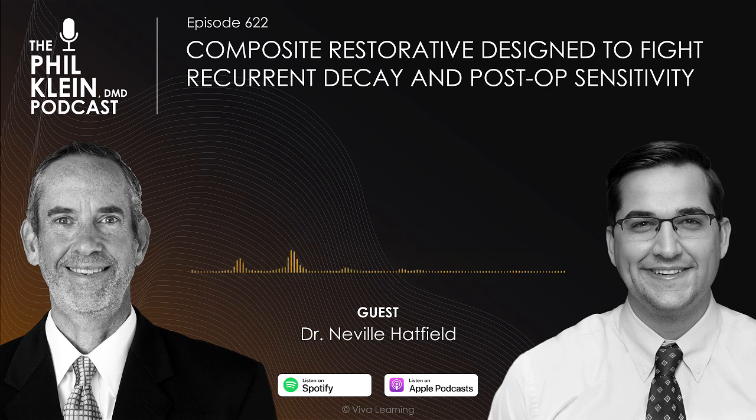Now, in terms of bonding agents themselves, there's one or two out there that are self-cured, meaning that you don't need to actually shine a light on it, but most of them again are light cured, so everything needs to be cured at some point in stage. Now, most newer bonding agents out there actually have an additive that allows you to use both light cure only materials and dual cure materials interchangeably without having to do an additional step.